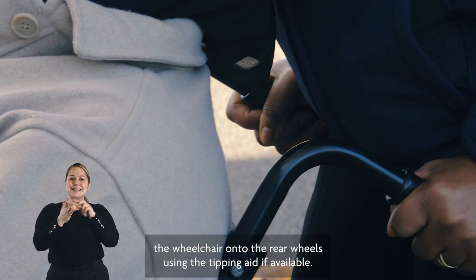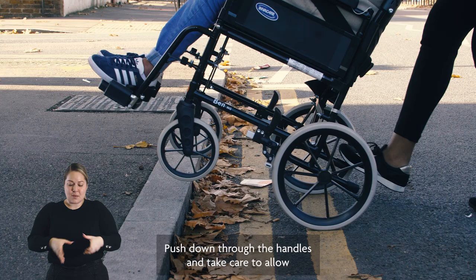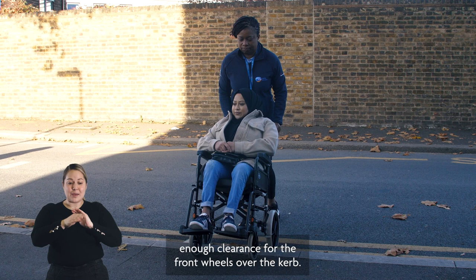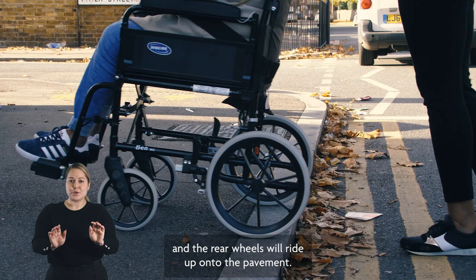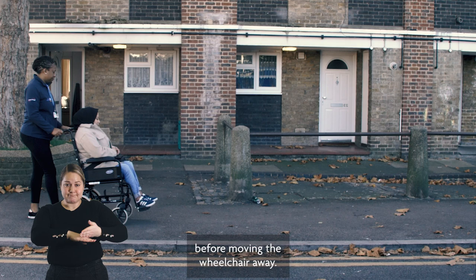When going up a curb, slowly tip the wheelchair onto the rear wheels using the tipping aid if available. Push down through the handles and take care to allow enough clearance for the front wheels over the curb. Then lower the front wheels and push steadily forward.